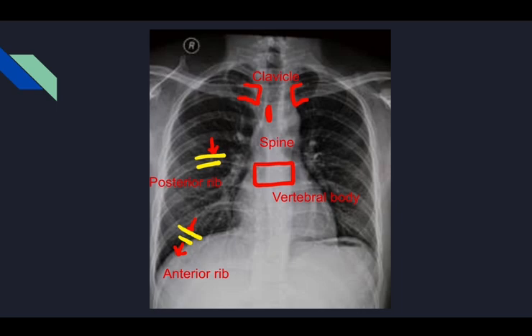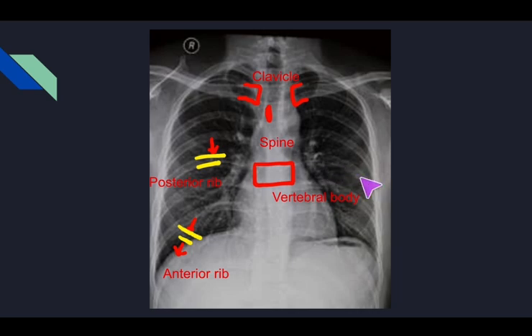It is equally important to examine the bones, looking for any fractures, bony lesions, or other pathologies. Always look at both clavicles to their full visible extent. Look at the spinous processes of the vertebrae and the vertebral bodies as far as they can be visualized. Also examine the ribs — both anterior and posterior. Posterior ribs run more horizontally, while anterior ribs are more oblique in their course.